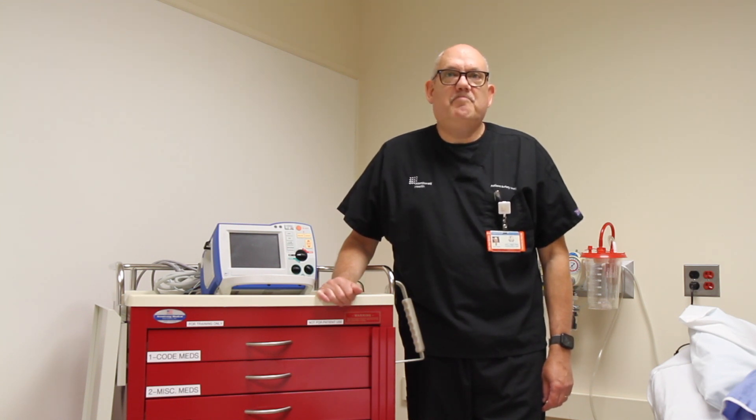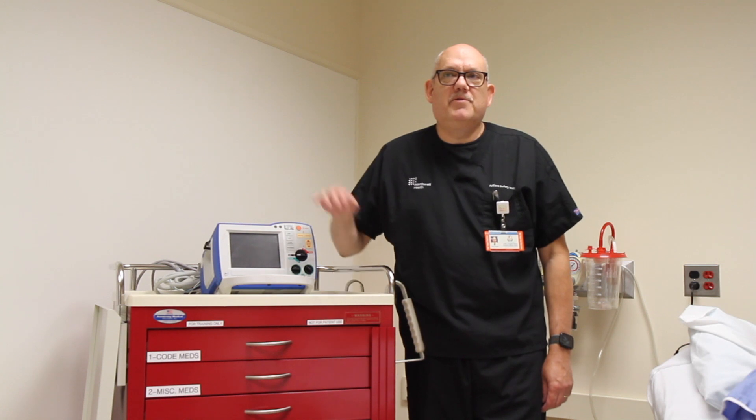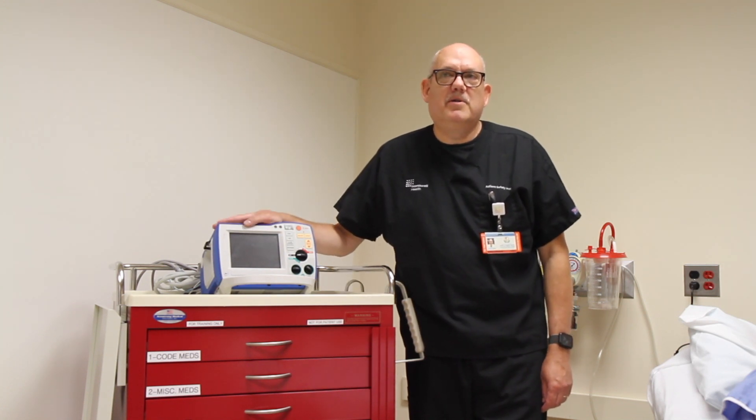Always check the patient. CPR should be continued while the device is being set up. You must be familiar with the devices used in your clinical environment. Most devices have all-in-one cables that allow for defibrillation, cardioversion, and pacing with hands-free pads.